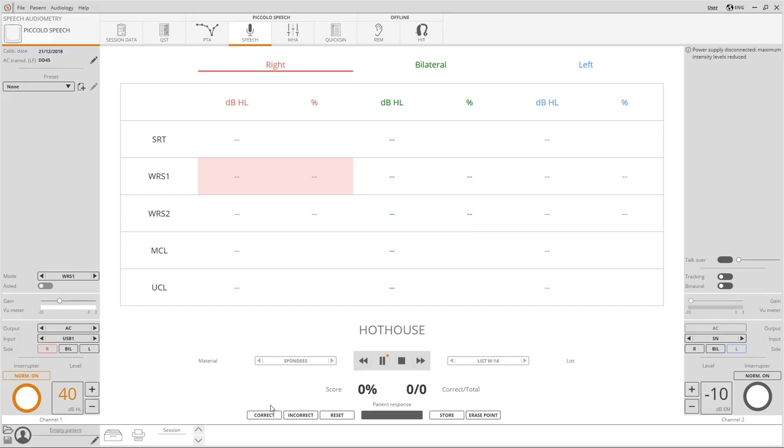On the lower part of the screen two buttons allow the patient's score to be calculated when the words are repeated correctly.